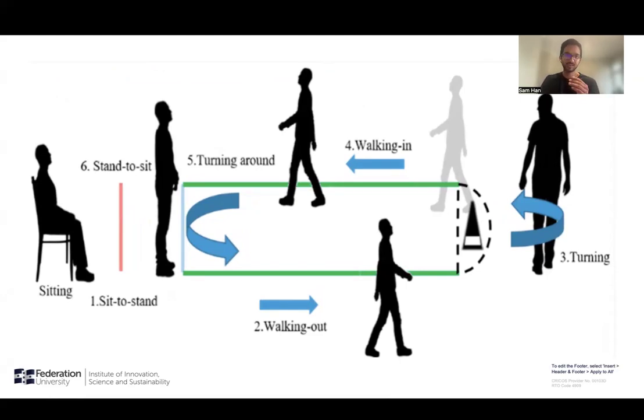The entire time taken for this process is measured, and if the patient takes less than 13.5 seconds, they don't have a risk of fall. If they take more than 13.5 seconds, they have a risk of falling. But as you can see, it's an observer-biased and time-biased system.